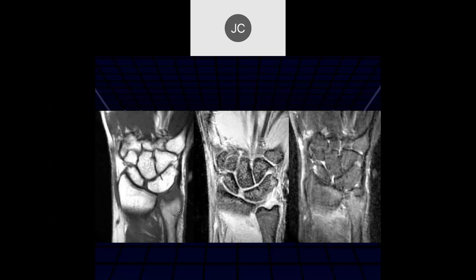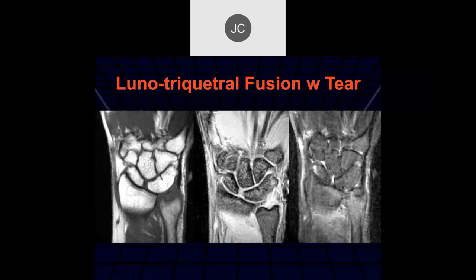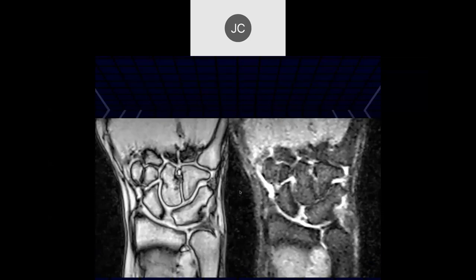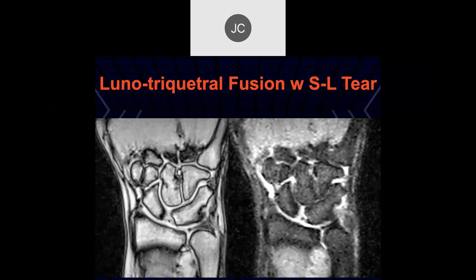Here's a similar bone fusion between the lunate and the triquetrum. Another fusion like this increases the stress on the fused bone — in this case the scaphoid — increasing the risk of scapholunate dissociation and tearing, which was present in this case. On a low-field 0.2 Tesla gradient echo sequence, we can see the fusion with scapholunate diastasis and tearing of the scapholunate ligament.